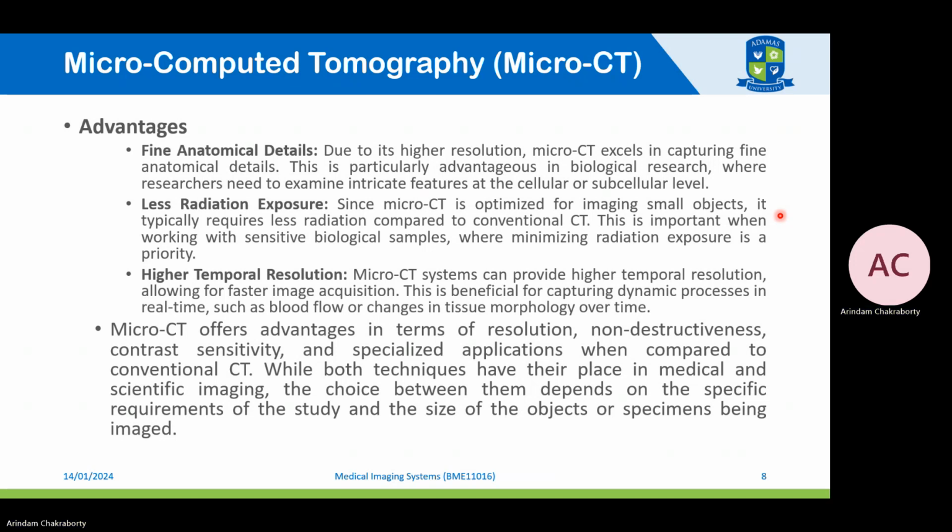Having said that, both micro CT as well as CT have their share of advantages: the resolution, non-destructiveness, contrast sensitivity, and special applications. CT can be used in clinical settings to capture internal images of a larger area. Therefore, the choice depends on the specific requirement. But when it comes to micro CT, the application is vast, particularly in the domain of biomedical research or mineral science related research.